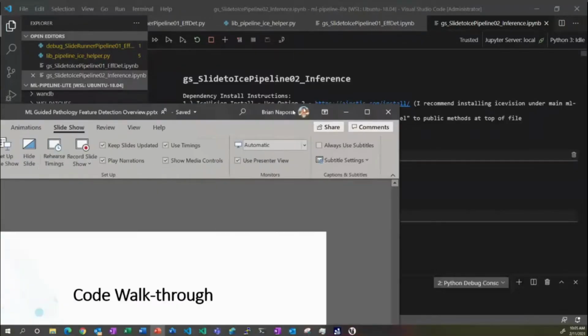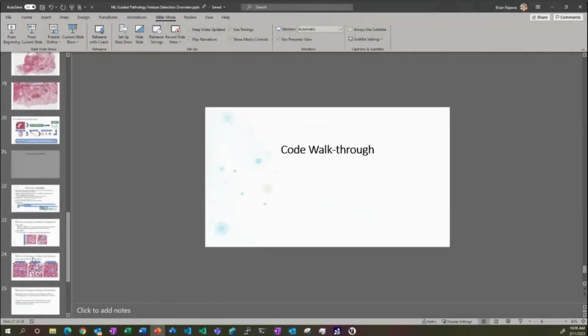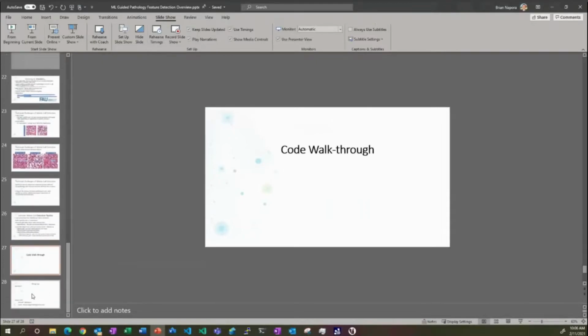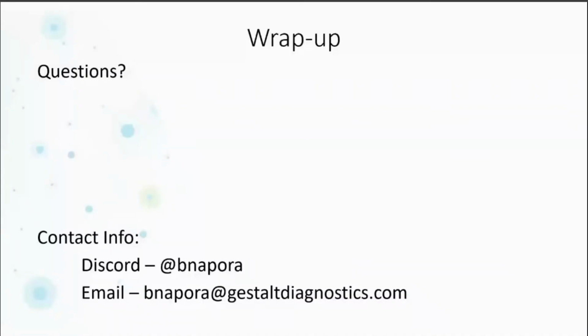Did you see a really noticeable difference between EfficientDet and some of the other mechanisms? That might be an interesting thing for folks to think about, especially with the recent inclusion of the MMDet models. There might be one or two in there that would be even better suited for lots of small objects. I'd be interested if anyone has a thought about that.